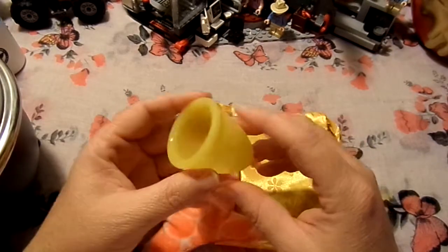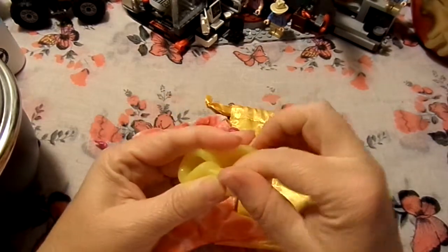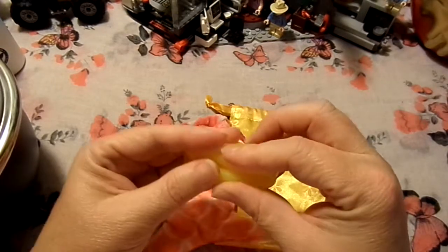It is very easy to get in and out. Again, with all my cups, I use the punch down fold.